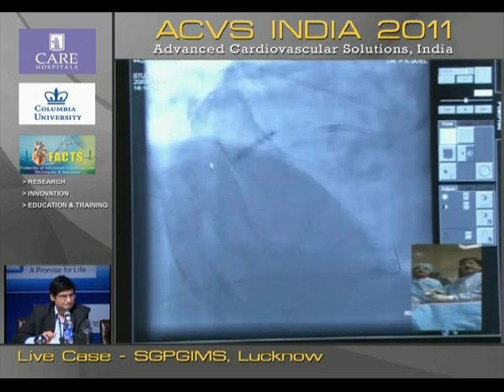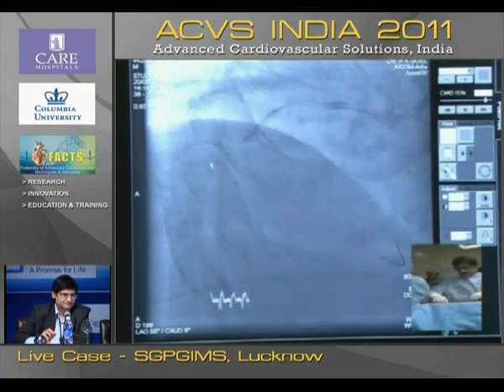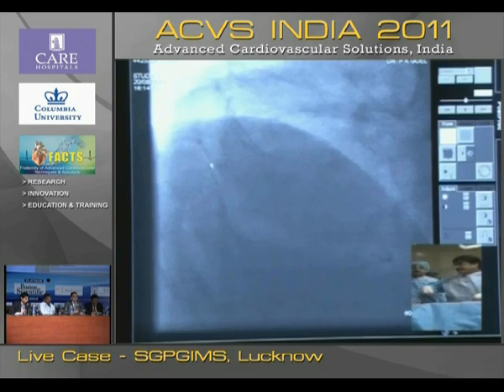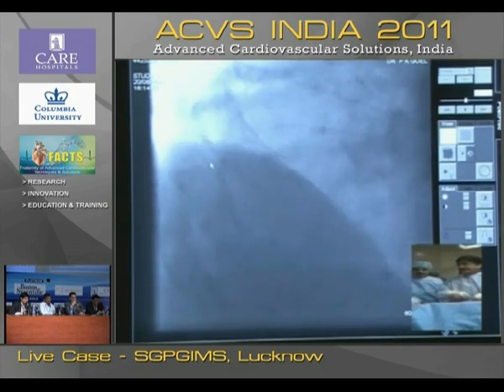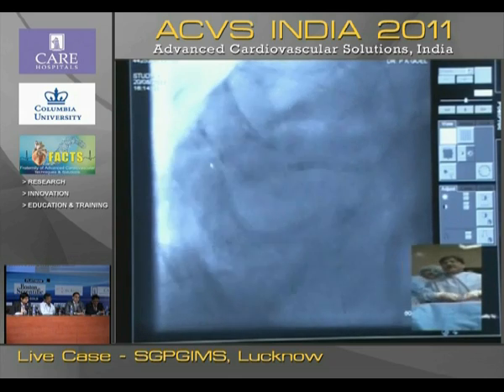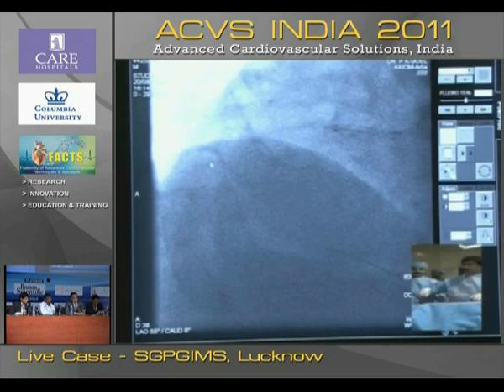Because with soft wires, what we are using is the penetrating technique. Soft wires will have resistance against the tough part of the lesion and will take the track of least resistance. Several of them are hydrophilic and they will immediately go subintimal. A tough, stiffer wire like Conquest will head through the obstacles and go straight, as long as you can direct it in the direction that you want.